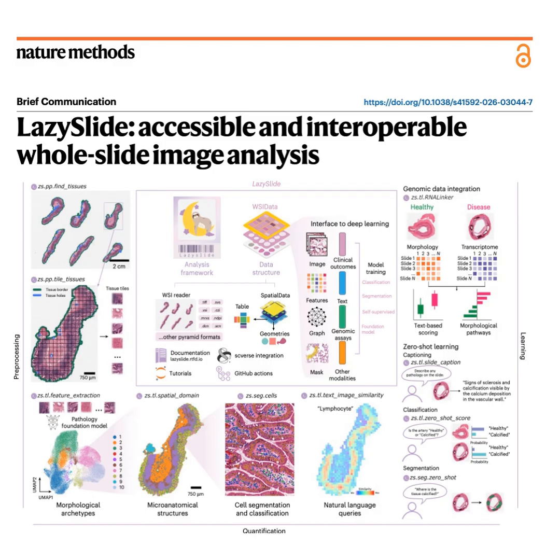Exactly. And it also has to ignore artifacts, things like dust, air bubbles, or surgical marker ink. So what's the first step? It executes this highly optimized computer vision pipeline, heavily leveraging the OpenCV library. It starts by converting the image out of standard RGB color into the HSV color space. HSV, that's hue, saturation, and value, right?